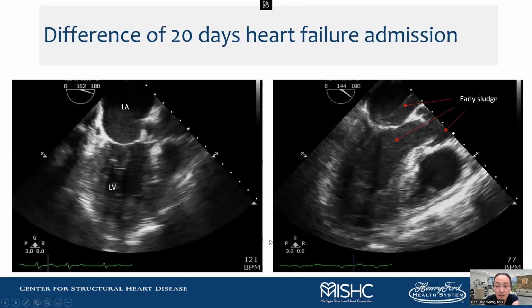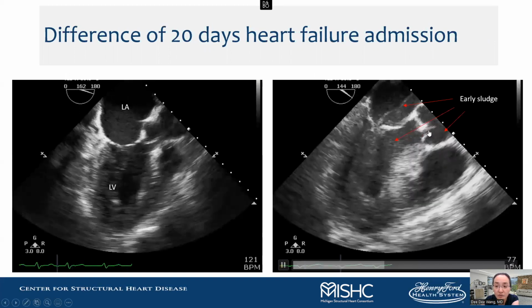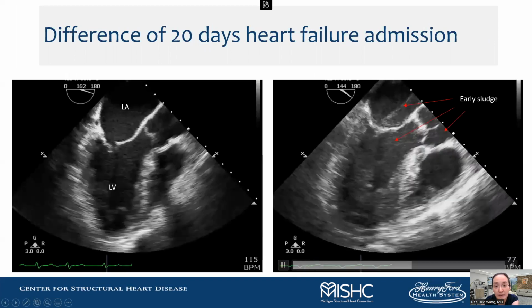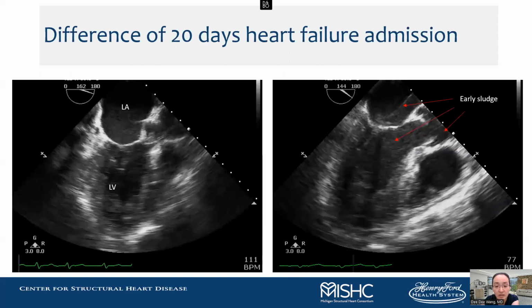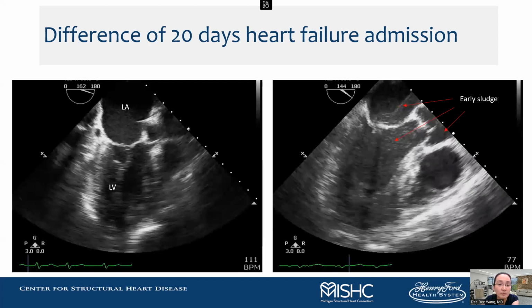This patient, as you were looking at the actual images when we dropped the probe, they were having sludge formation in the left ventricle, aorta, and the left atrium, and emergently had to go on ECMO. FMR, 20 days, presentation differences. FMR patients have very little reserve, and we have to do them as quickly as possible.